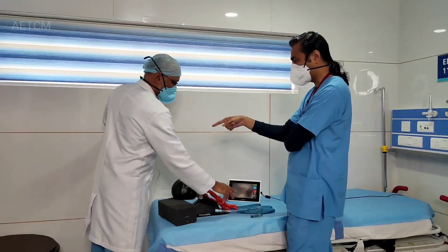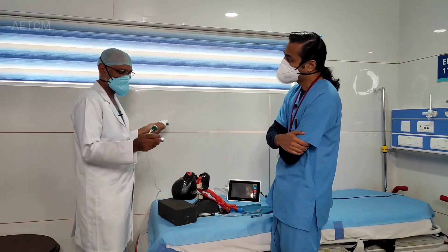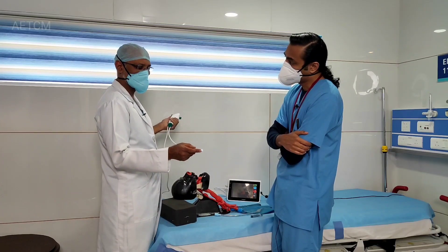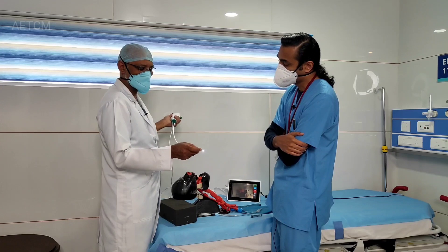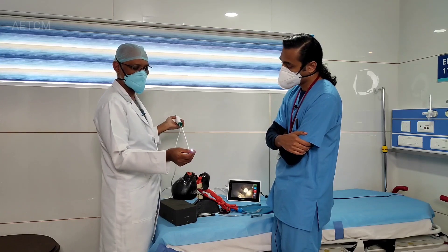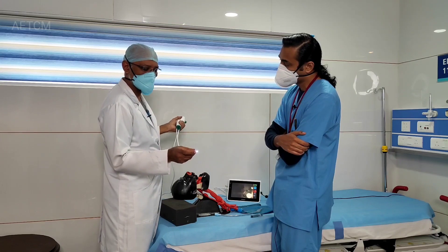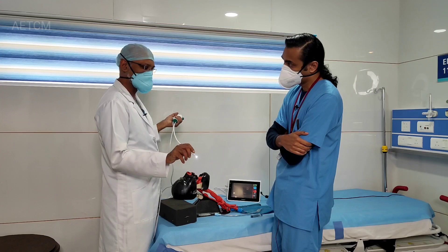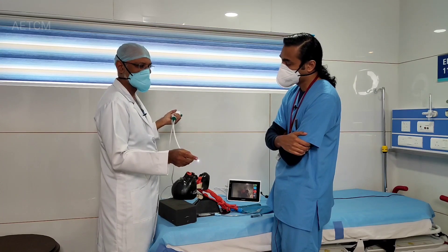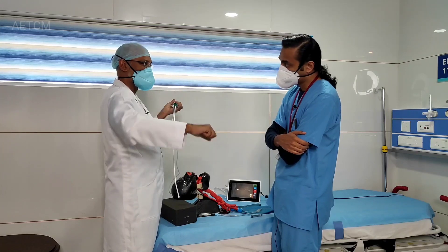Would a bigger tube or bigger scope help? With a bigger scope there's a problem — when there's a disparity between the size of the scope and the tube, it becomes difficult. This is a 5.5 size bronchoscope, so if you use a 6 or 6.5 size tube it's okay. But if you go for an 8 size through this, the difference in size is what creates difficulty getting across the vocal cords.